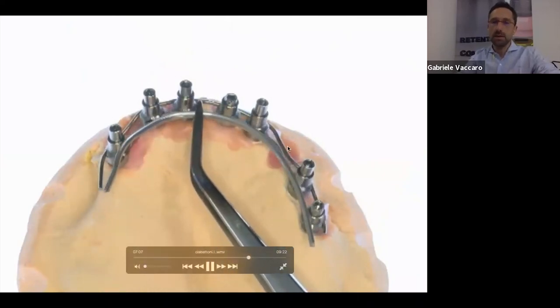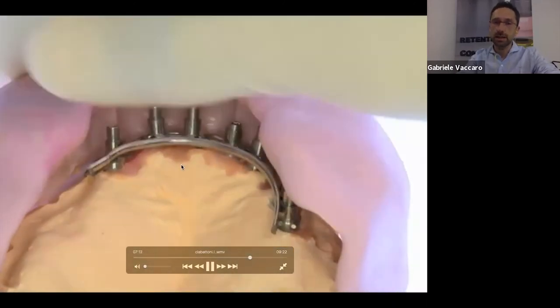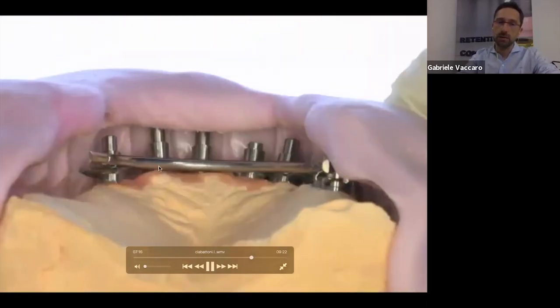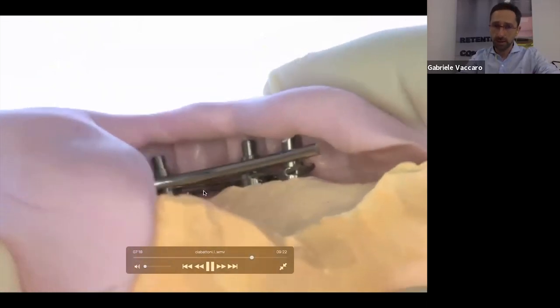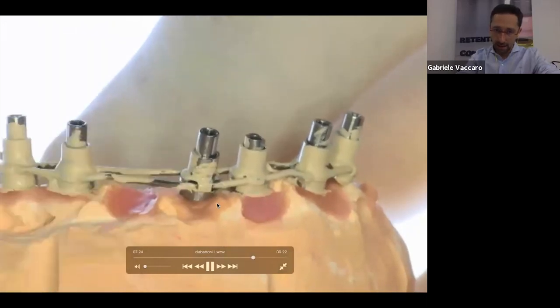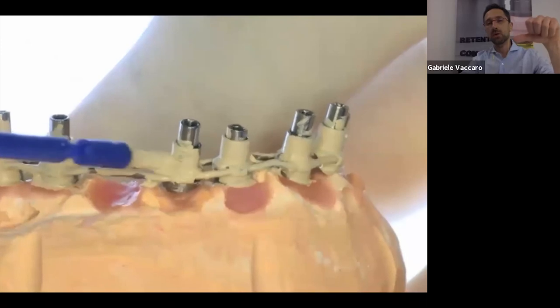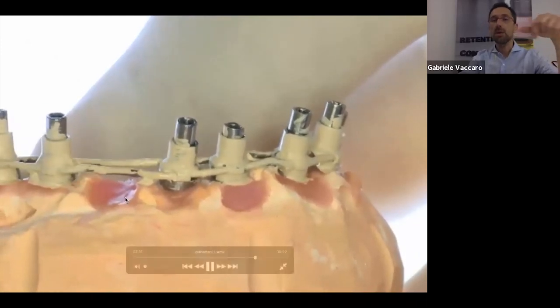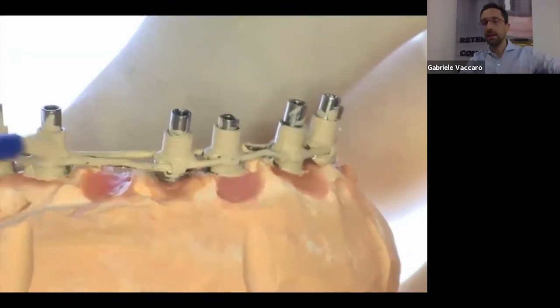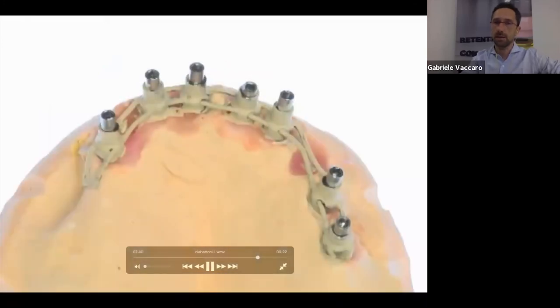Another detail, very important detail, remember that this is a surgical impression, so it has all the sockets, all the sutures, all details of the gingiva, of the wound. So close them with wax everywhere you can, like this. This is wax, because otherwise the resin that you are going to put in will get into the socket or here. And it's time consuming too. It's faster if you close all the holes, all the imperfections here with wax before.